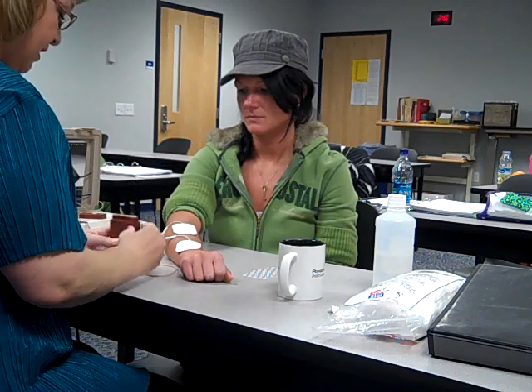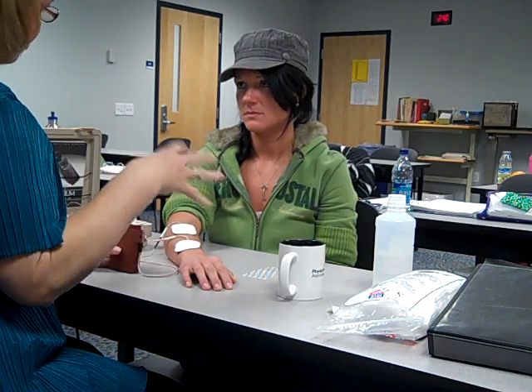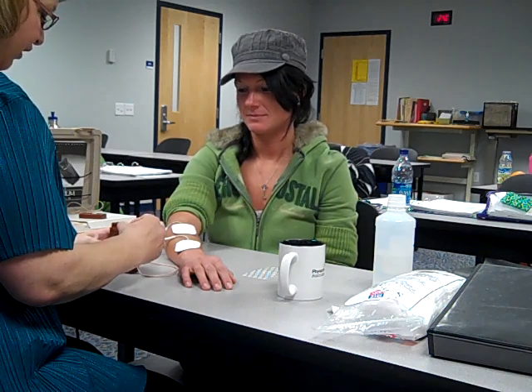This is where I can double check before she feels anything. I'm going to start turning it up. I want you to relax your hand — there you go. Tell me when you first feel anything at all. It should just feel like a tingly feeling; it shouldn't be uncomfortable at all. If it is, let me know. Oh, you're going to love this — this is going to feel really good.